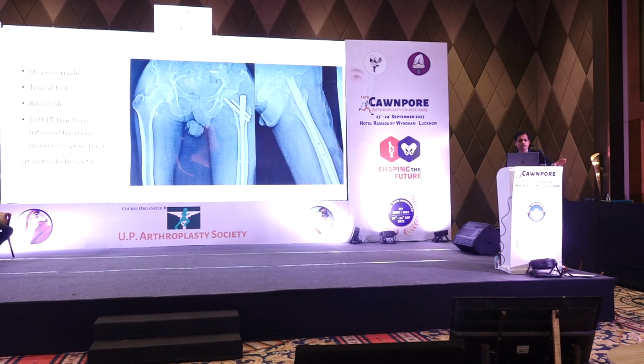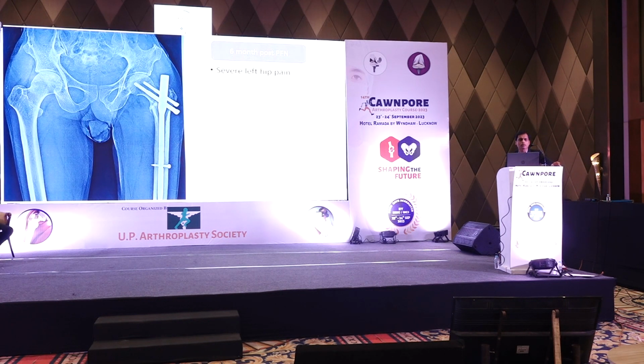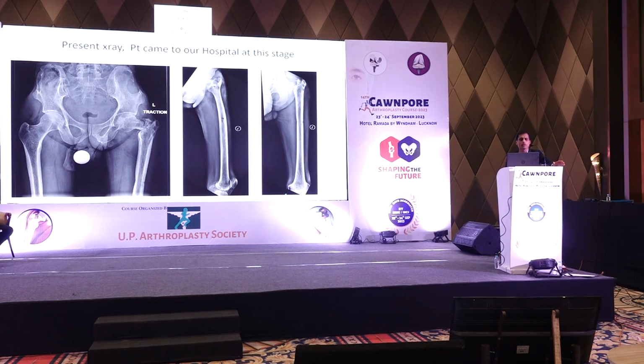Again, a 56-year-old male, trivial fall, alcoholic, IT fracture. A trauma surgeon can discuss the ideal situation, but in the end it has to be whether it is an unstable or a stable fracture. Select the correct internal fixation. Here at 5 months and 6 months post-op, the patient is having pain, but the surgeon was waiting for the fracture to knit. That is again the wrong thing. Address it appropriately in the right time. What next? At 8 months post-op, the patient is not able to walk. Still the surgeon was waiting, and finally the local surgeon removed the implant and made the patient start walking, but still the fracture did not unite. So this is how the patient came to me.